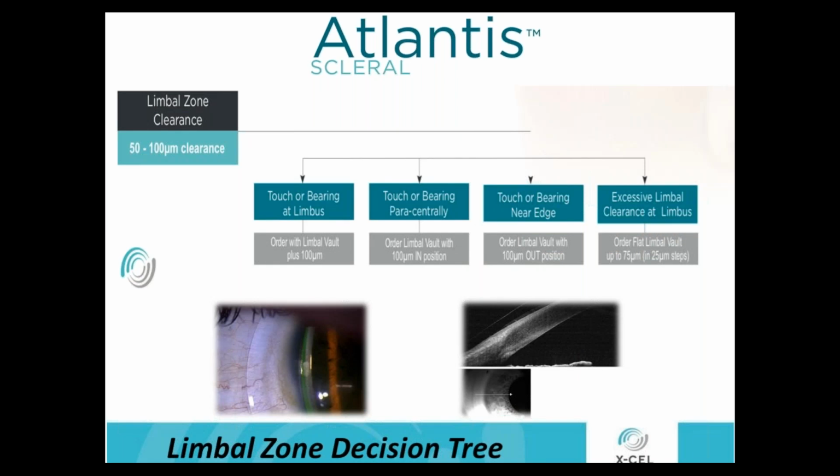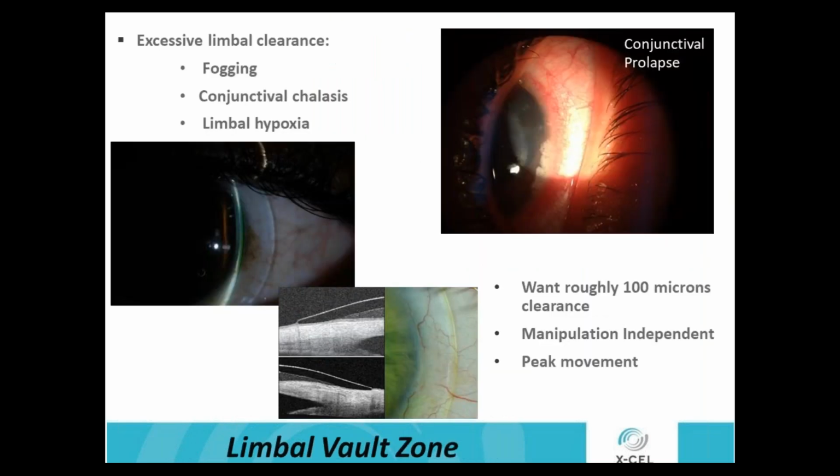Now, when we're looking at the limbal zone, same thing. We have to have our goal, and then we have to be able to evaluate what we're seeing from that goal to make our changes into that limbal zone. And the limbal zone is really nice because most limbal zones and most designs work independently, meaning whenever I make a change in that limbal zone, it doesn't have anything to do with my central zone or my edge. So I can increase or decrease that limbal zone accordingly, depending on the problem. All right, and then I can make those changes to solve that problem.